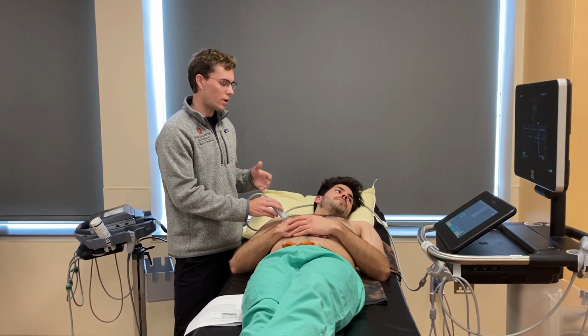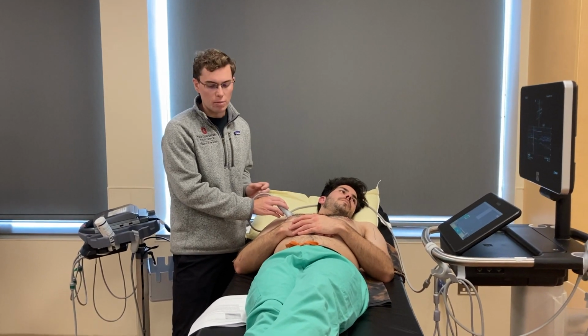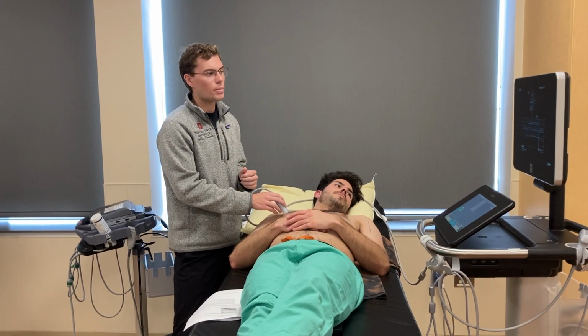Other tips: when you're looking for pneumothorax, you want the patient supine. For an effusion, more upright. Any consolidation or interstitial pathology really doesn't matter what position they're in.